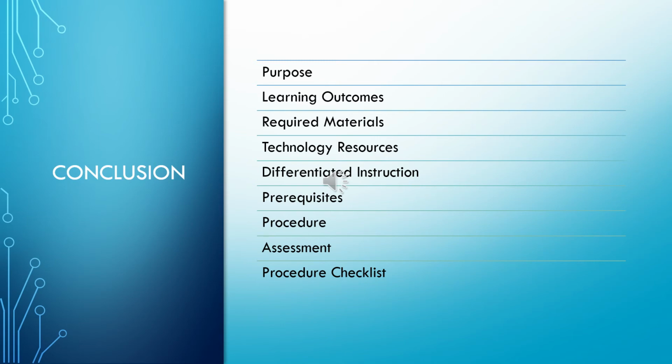We also looked at the learning outcomes. What are we going to take away from this lesson? Mainly, how do we test the blood glucose on our patients? We looked at the required materials, and again, be cognizant of the fact that there are many different glucometers on the market today, and more of them coming. So be aware of that, and if you are presented with one to use and you're not familiar with it, look for the instructions, or get training on that piece of equipment before you use it.